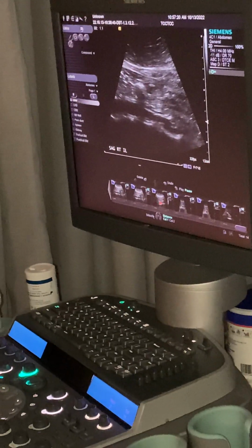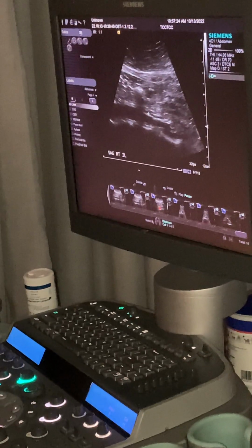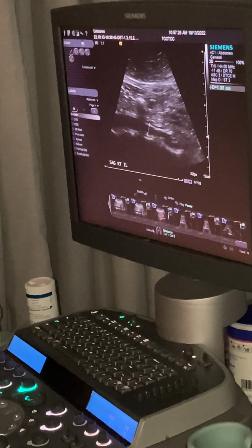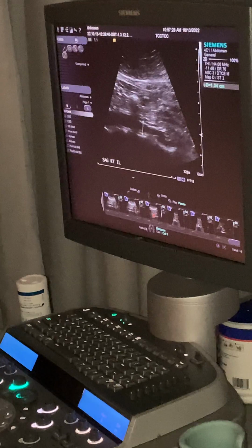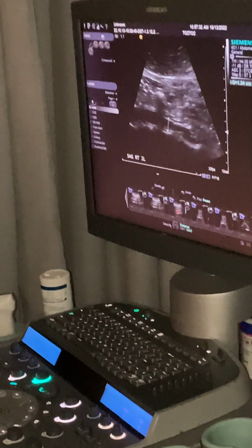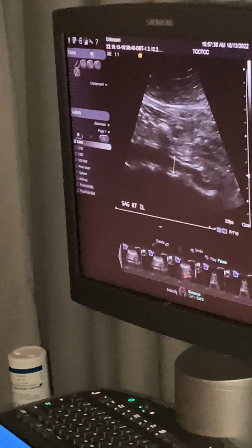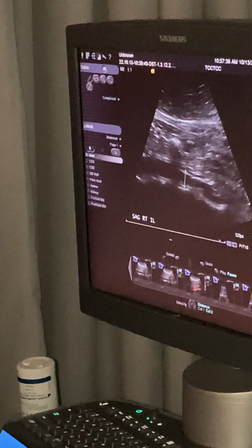Okay, so let's get our caliper outer to outer. Now we have a little bit of a downhill going here, so we're going to have a bit of an odd angle. We want to make sure we're 90 degrees to that iliac. We had that horizontal aorta, so things were pretty top to bottom AP with our calipers, but since this guy's starting to dive down, our calipers have a little bit of an angle.